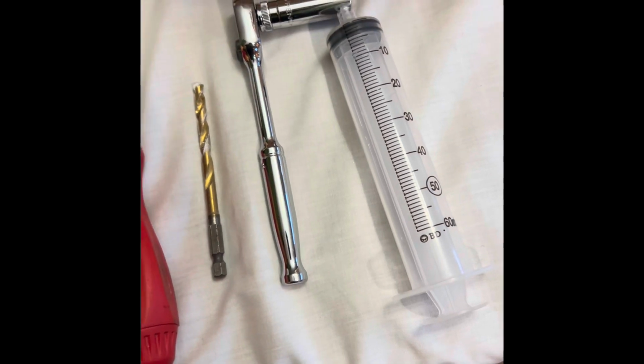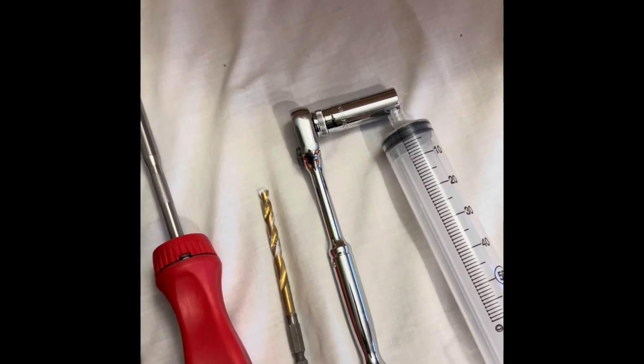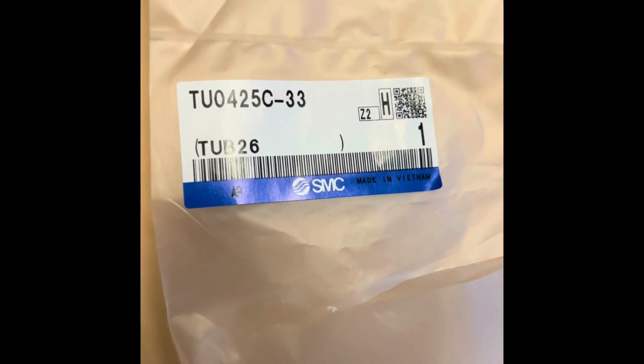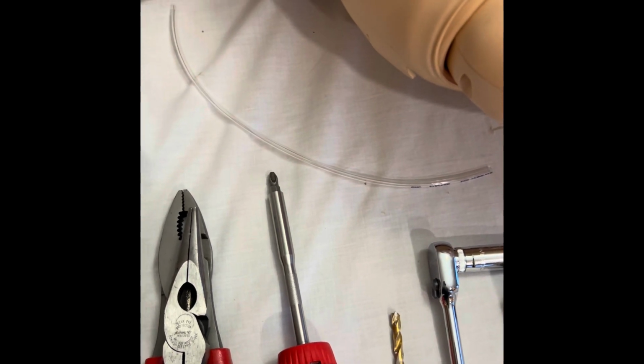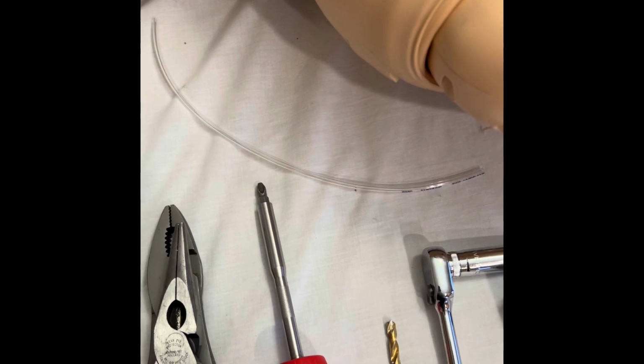I also recommend getting some of this tubing from SMC. It is the part number TU0425. The company is SMC. You can buy it in different lengths. Here's the part number. Not super expensive, and you only need a foot of it, so buy the smallest number you can buy. But this is good for any of the SimMan 3G or Essentials replacement tubing on several areas, not just the arm here.